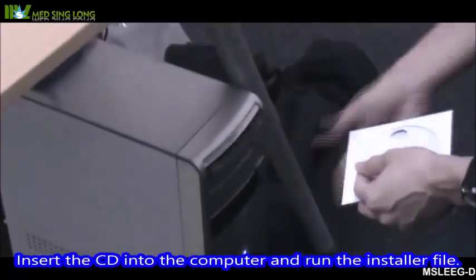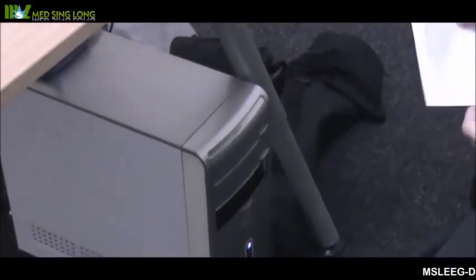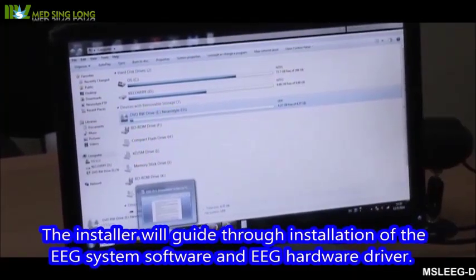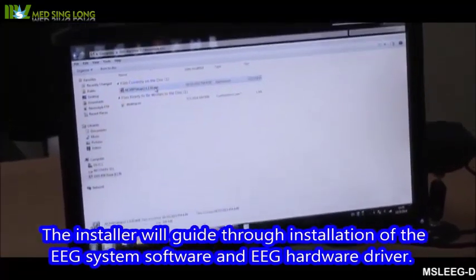Insert the CD into the computer and run the installer file. The installer will guide through installation of the EEG system software and EEG hardware driver.